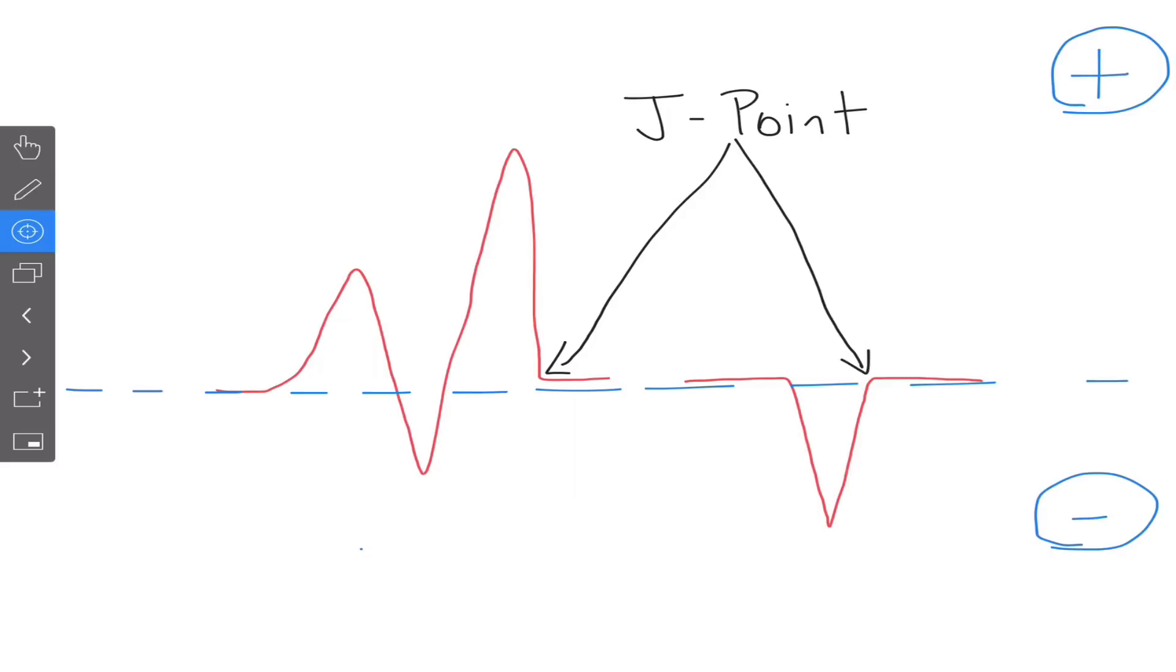So for a left bundle branch block, we have to have a QRS again greater than 0.12 seconds and then deflection before the J point should be negative or down. And you can also see rabbit ears in V5, V6, and even lead one.